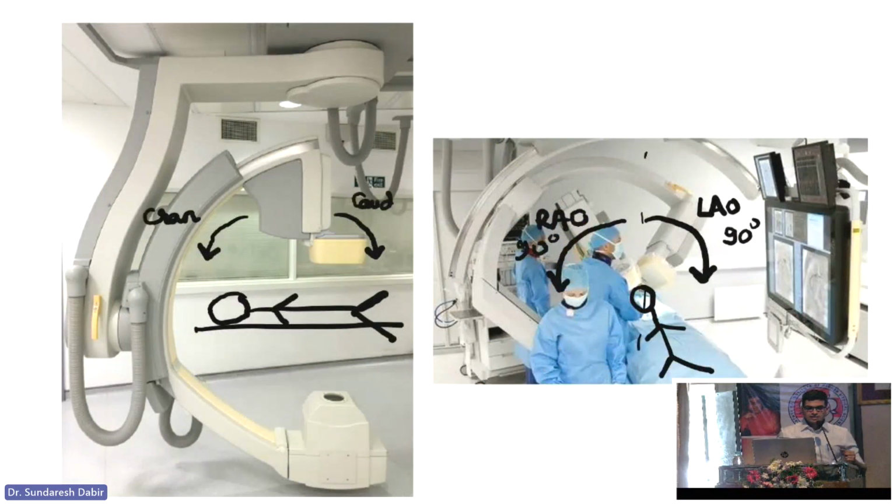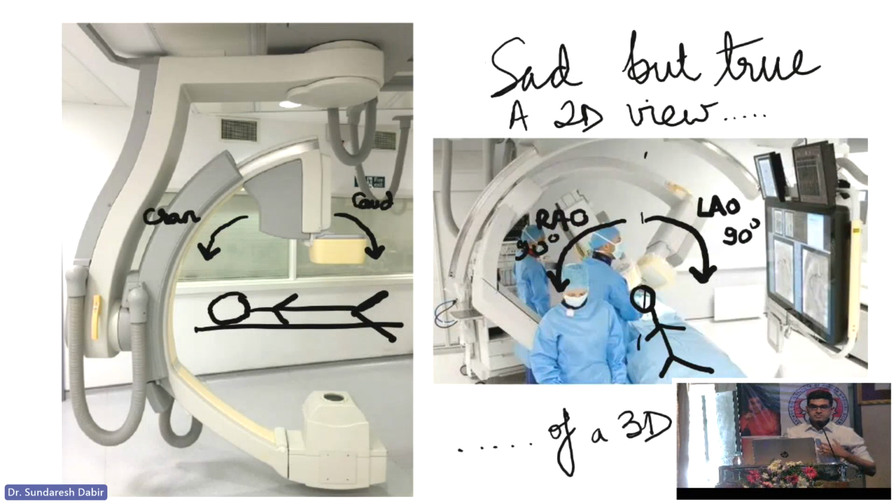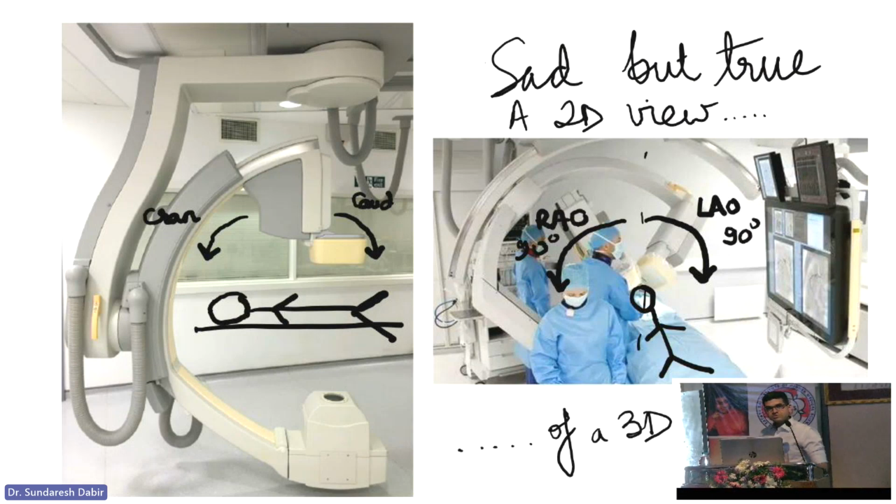Before the C-arm was invented, how would people take LAO, RAO? It's very simple. Suppose I am standing in front of the X-ray tube and you want to take a LAO for me, I have to turn to the right. Similarly, if you want to take a RAO, I have to turn to the left because the projection plane will not change. But since the C-arm came, the patient doesn't have to. That's the basic idea of how a C-arm works.